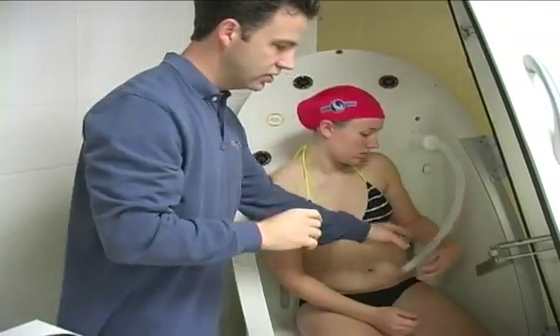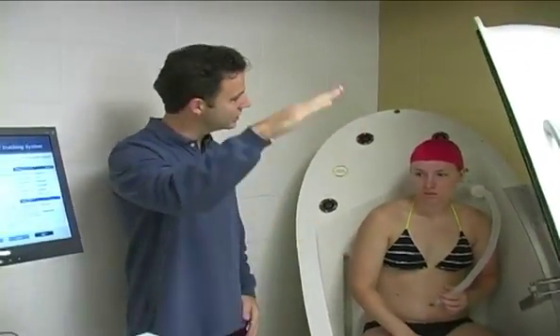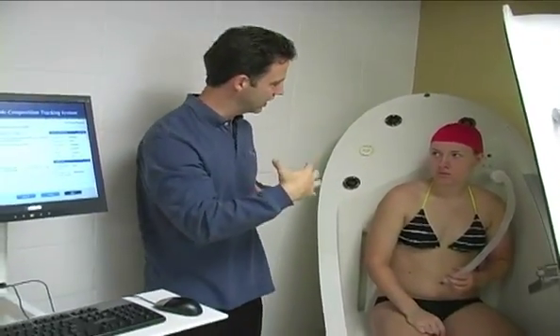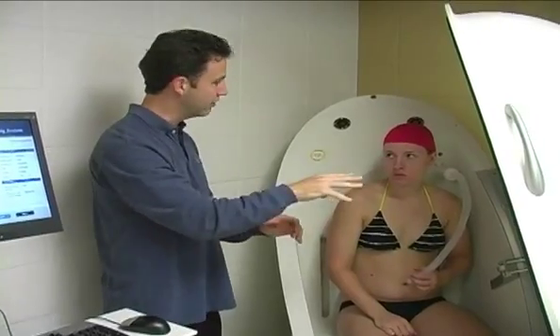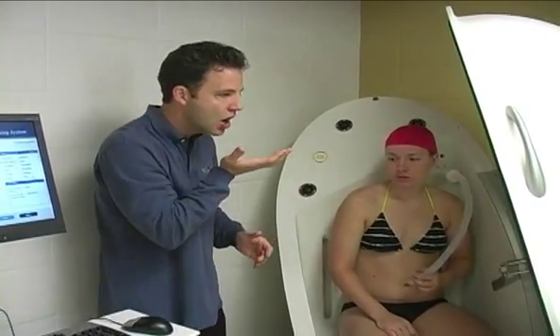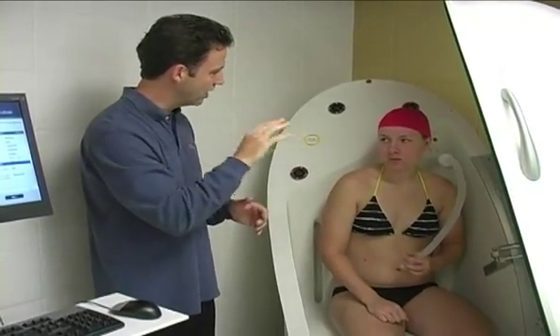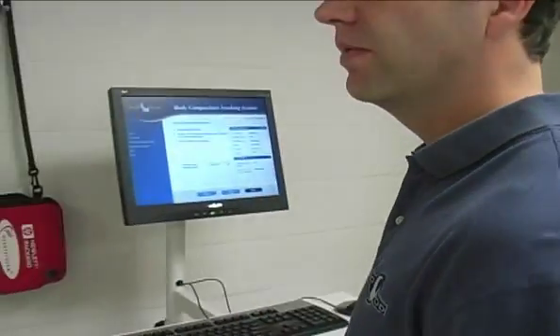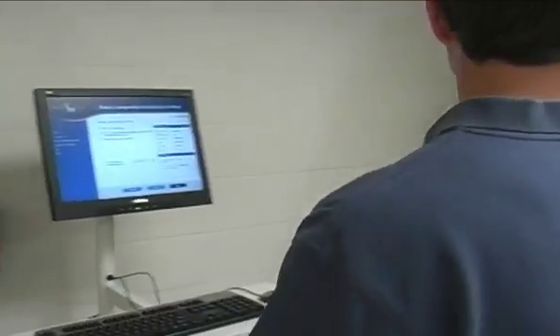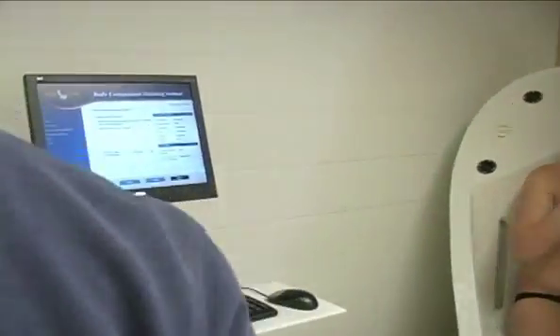So again, just to review, this will prompt you to put tube in mouth, plug nose. There will be a cadence. Try to match that cadence of breathing in and out. Then it will say prepare to huff, don't huff yet. It will say huff. Then it's out, out, out, and try to maintain a tight seal. All right. So, we've reviewed. And then we take the tube out after? Yes, and then after the 3 huffs, you're finished. So, click next, excuse me.